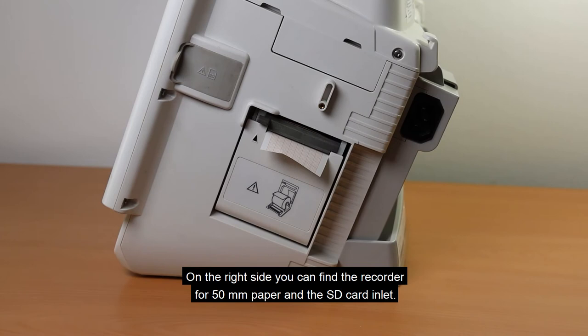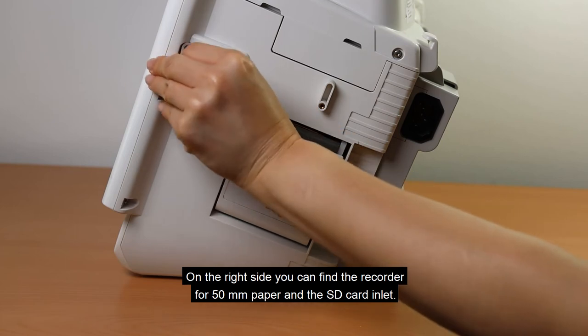On the right side, you can find the recorder for 50 mm paper and the SD card inlet.